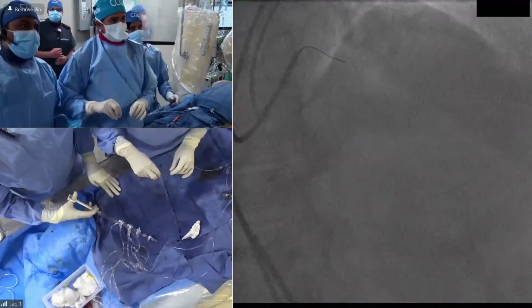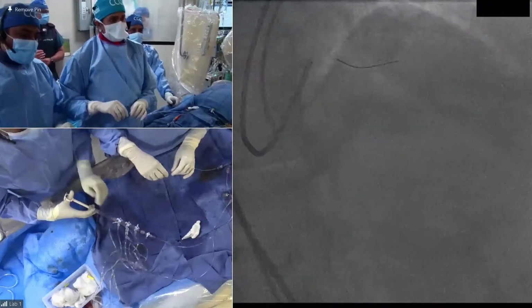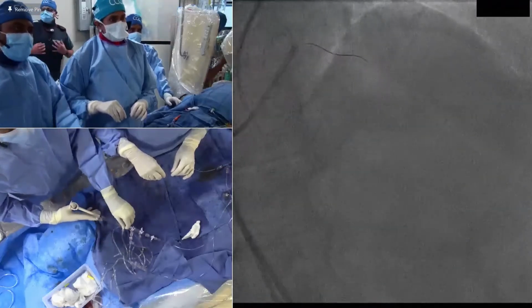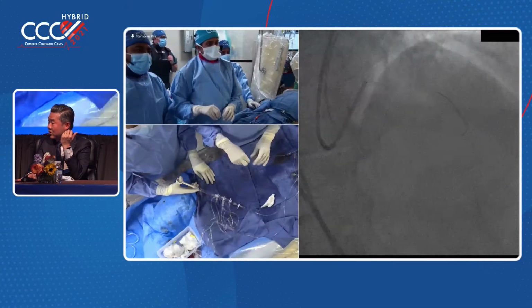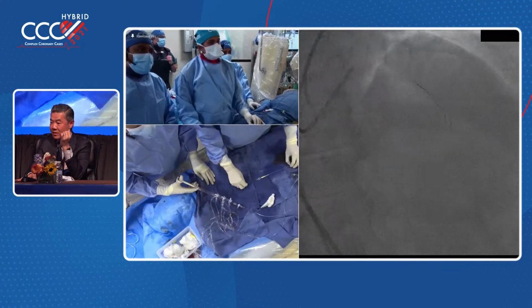George, we actually just stopped using Fine Cross. Caravels have taken over in our lab. They're cheaper and more deliverable. You could also torque it a little. But for CTO, I think you'd like to use a Corsair because you really want the possibility of torquing through that CTO.